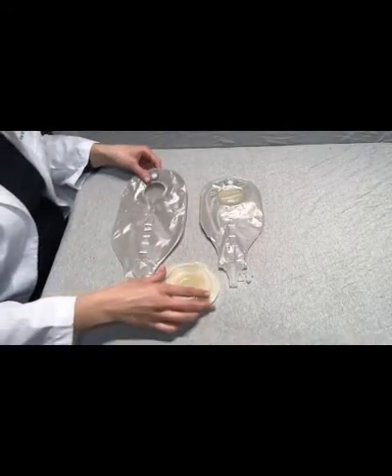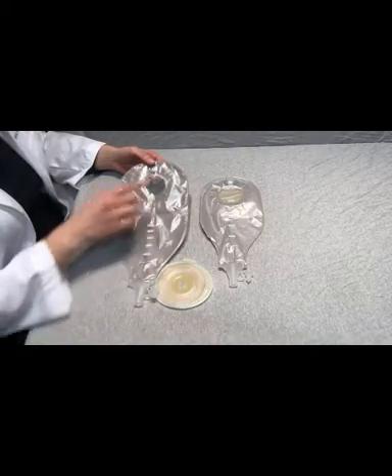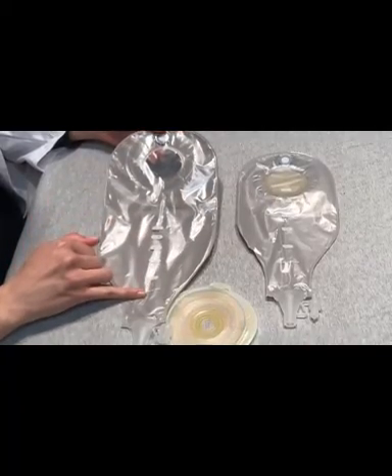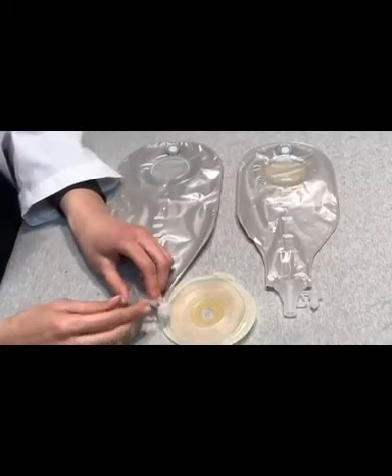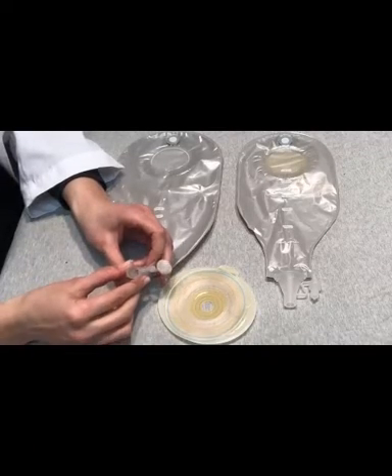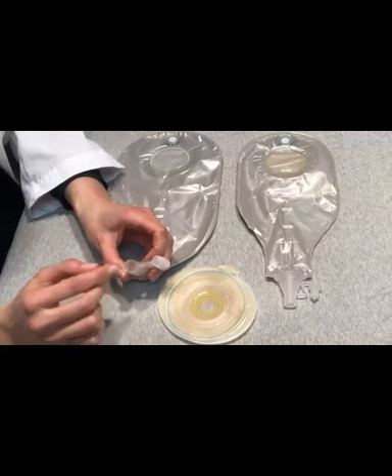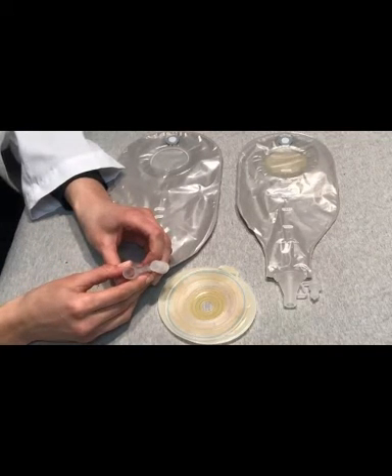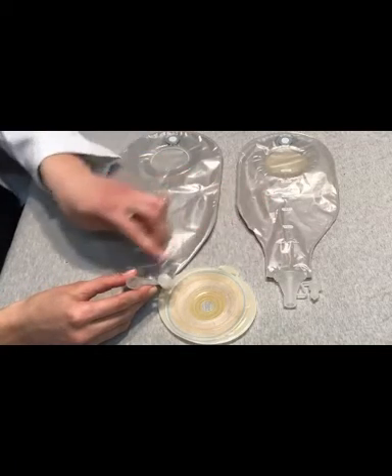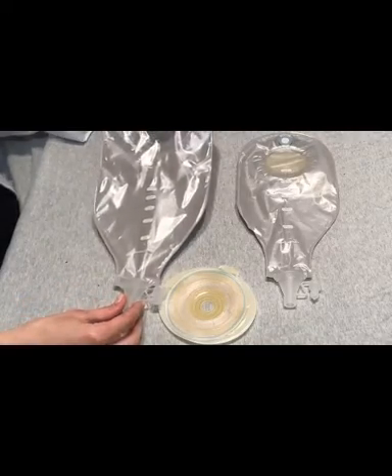This particular pouch is our two-piece high output flex. Same features on this pouch. We have the filter here, visual cue as well to help with measuring. This particular outlet is called a tap outlet. The tap outlet is a little bit wider. This helps with emptying thicker high output stool. So this actually can connect to our fecal drainage bag. You may not have this in your facility, but I do want you to keep in mind that there are two different kinds of outlets with our high output pouches.